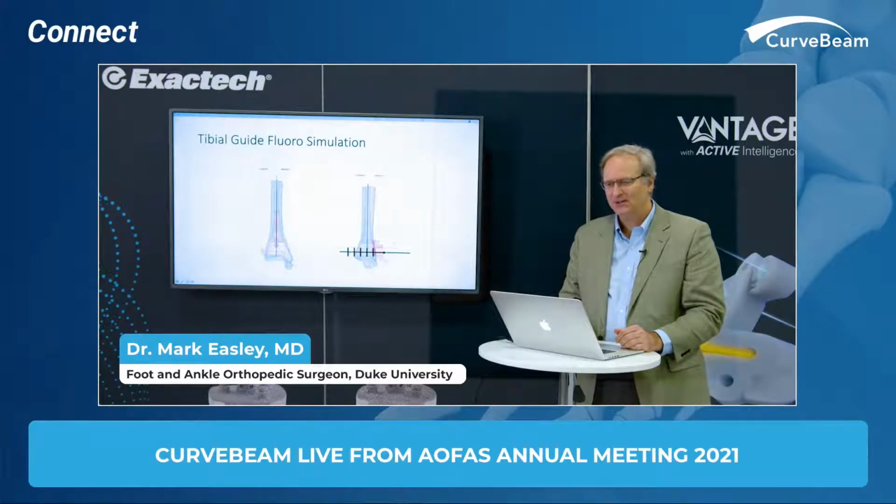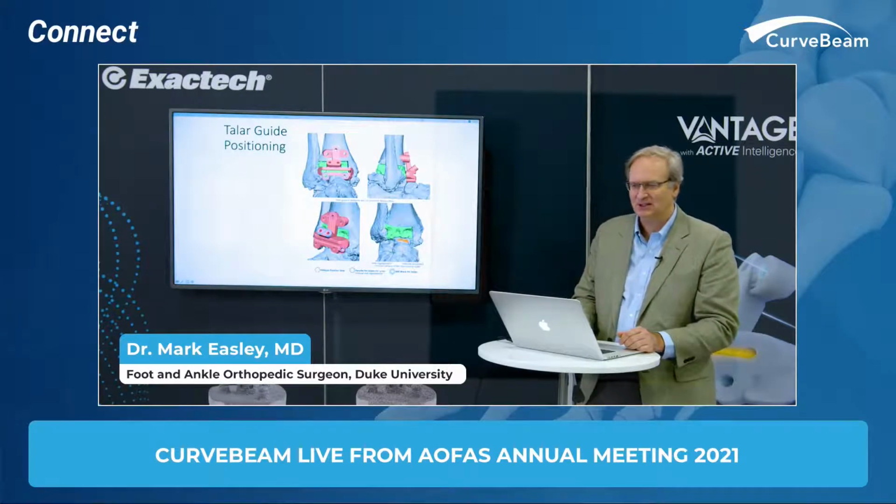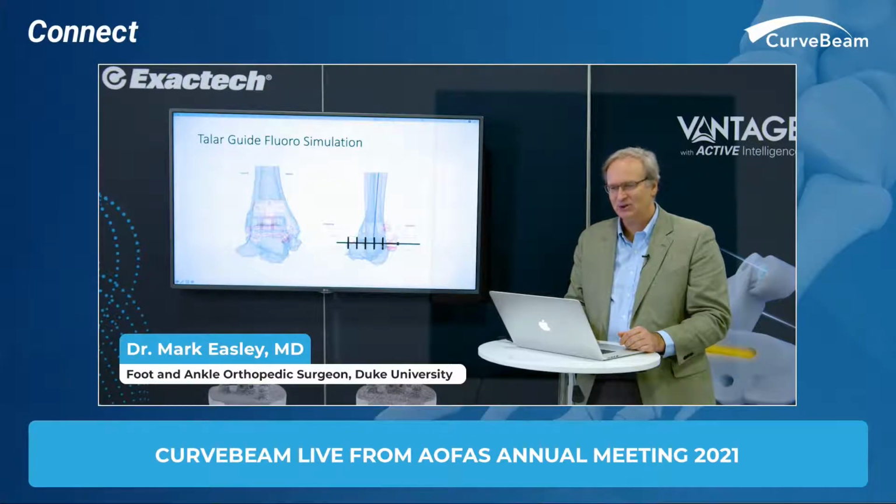And what I love about this one case I wanted to show you was that the tibial osteophyte is so far down anteriorly that in order to then make the talar cut, I had to cut through the tibia again. No problem. See, 3D systems had no problems with that at all. So you can see the talar guide positioning. And I just didn't pick up on it at all until I got to this stage. And in surgery, I said, my God, I'm actually going to cut through the tibia to make the talar cut.